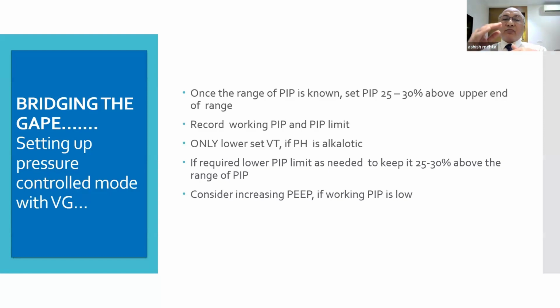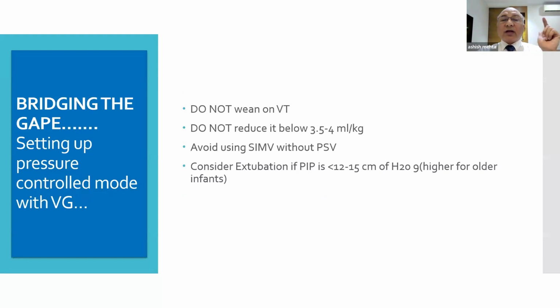Believe me, with improvement in the chest compliance and the lung compliance, PIP automatically starts coming down, because now there's volume targeting. PIP is also auto weaning. In assist control mode, if the baby is breathing adequately, you will find PIP coming to 12 to 14, depending on the baby's condition. Rate is not to be weaned; auto weaning happens.